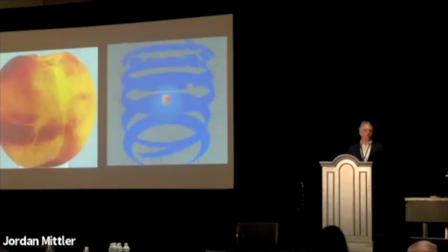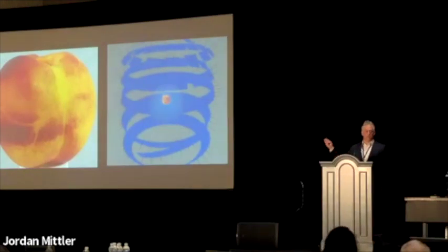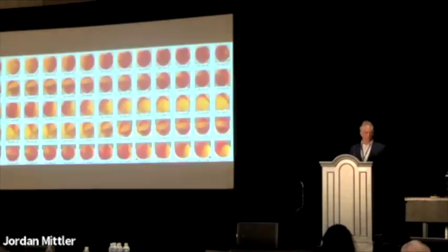If I wanted to take an image, say I take this piece of fruit and I wanted to make a 3D image of this, you can see on the right side in the blue, photogrammetry is basically taking a bunch of photos. Those black line angles are just photos taken of the apricot in different angles and different positions. Hundreds of photos.